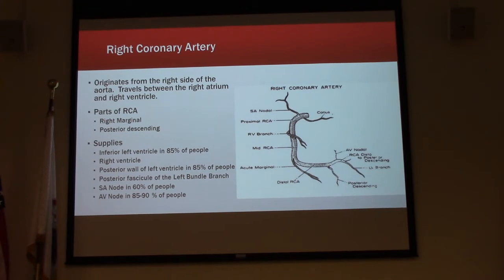We miss pre-hospital, and actually within the hospital too, about 50% of all posterior wall MIs. You have a patient who has chest pain, and you're looking at them and you're thinking, okay, I'll put them on the 12 lead, and you see nothing. No ST segment elevation. You're like, oh, yeah, they must just be having something else going on. But we need to take a look at the back of the heart. We need to do maybe a 15 lead or adjust some of the leads to make the determination. Are they having an occlusion in the posterior wall of the heart? What am I actually seeing?